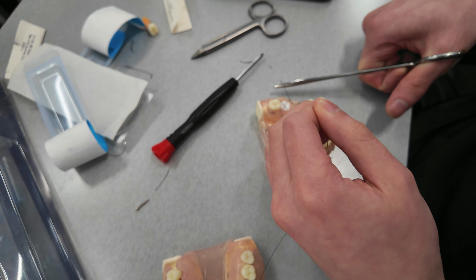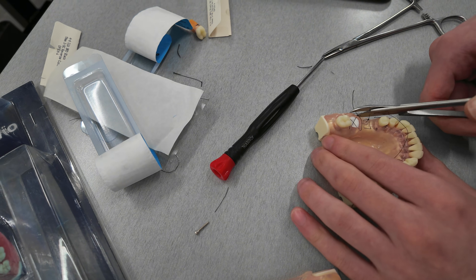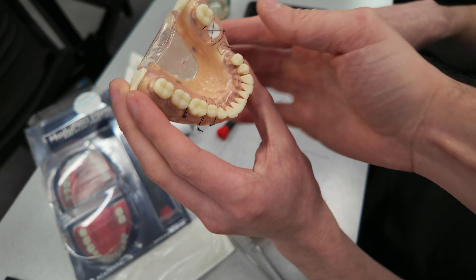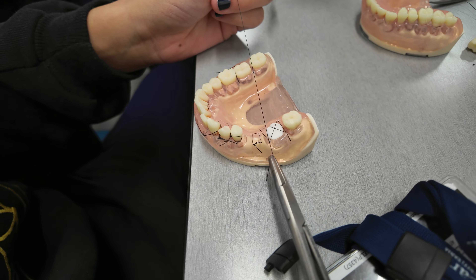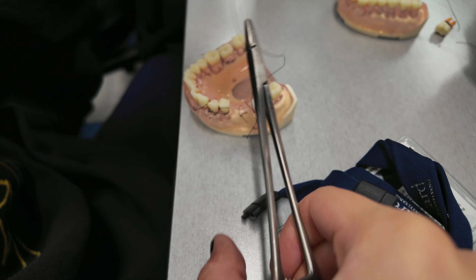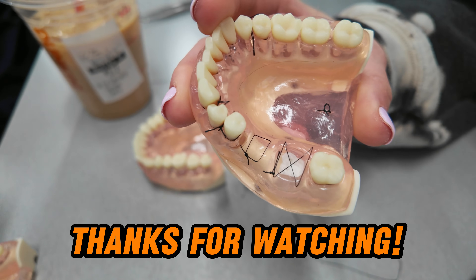We cut the sutures — those scissors are so much sharper. Final result. Gabby's sutures are really good — solid.